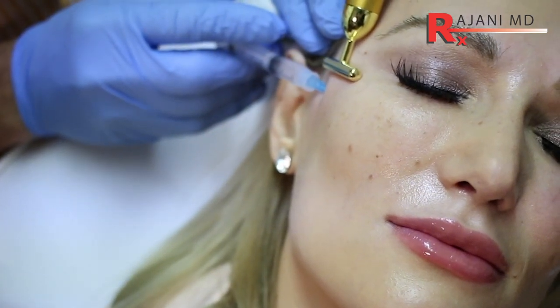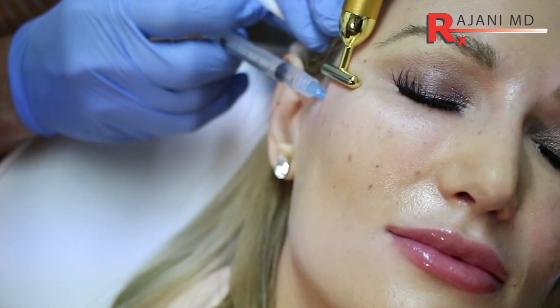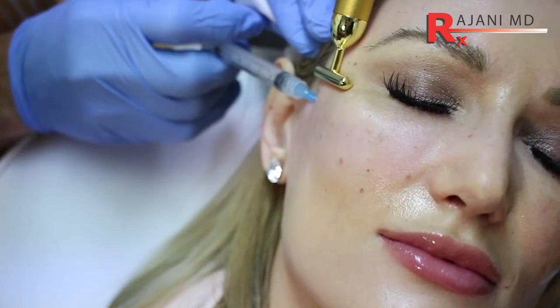Two other important factors: don't hit bone, because the periosteum will cause clogging. Also, when pulling back on the syringe to aspirate, Sculptra is water-based, so you don't have to pull back hard or long. If you're using hyaluronic acid or calcium, you do need to pull back harder and longer. With Sculptra, the minute you see a little air bubble in the hub of the needle, that's all you need — because it's water-based, if you're in a vessel, blood will appear immediately.